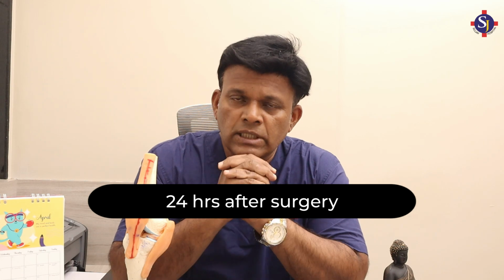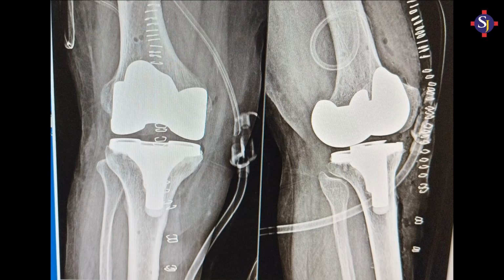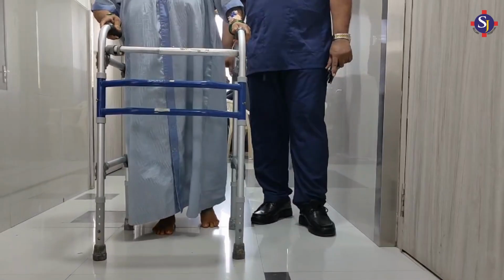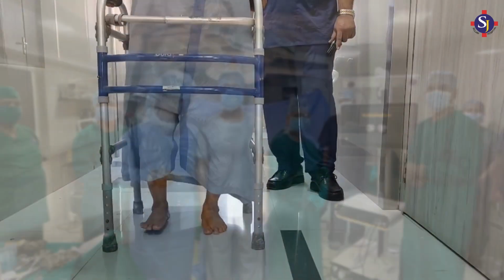We talked about the surgery yesterday, and today it is now 24 hours post knee replacement surgery. The patient is doing very, very well, beyond our expectations. She's a really cooperative patient, and the physiotherapist also has done a wonderful job. Patient has walked very comfortably, and I expect her to make a fantastic recovery. This is the post-op X-ray of this patient. You can see the implant is sitting very well, and the cuts are so good that the patient has started walking today.